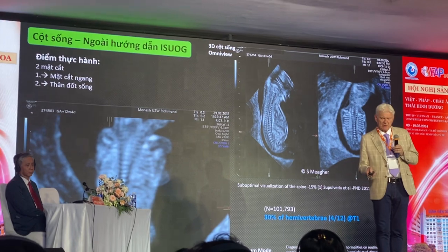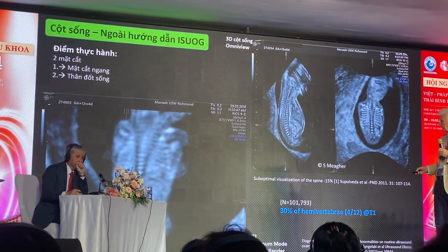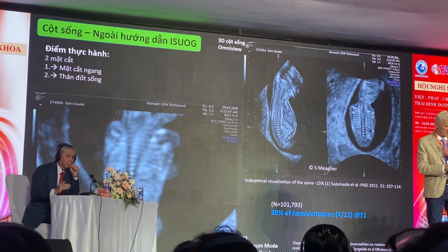This is another example looking at the spine of the fetus at 13 weeks of gestation. So if we run the video clip, this is different from what I'm seeing.